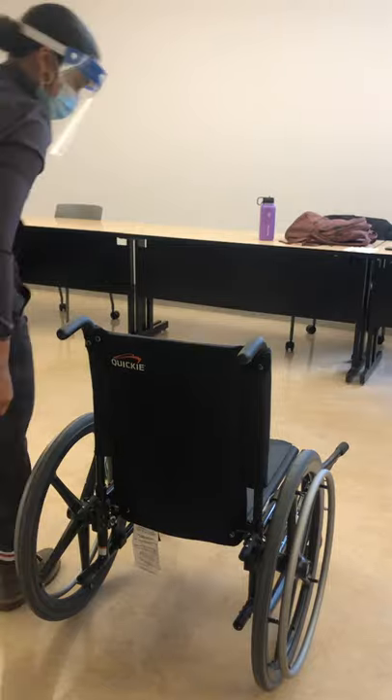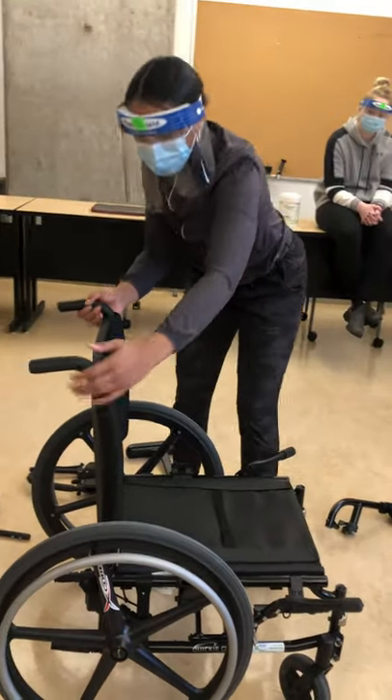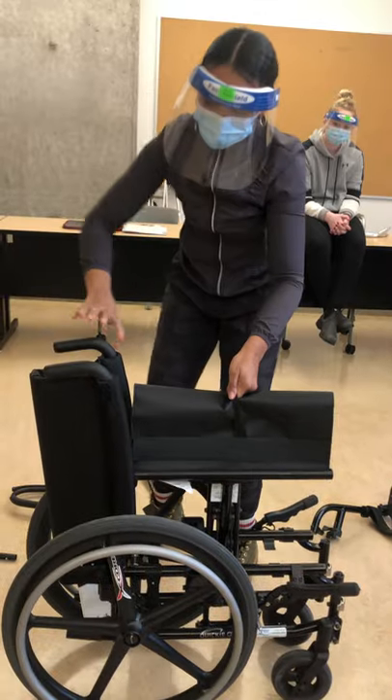Now what we're going to do is fold the wheelchair. To do that, we're going to insert the middle and pull the strap up on the seat.